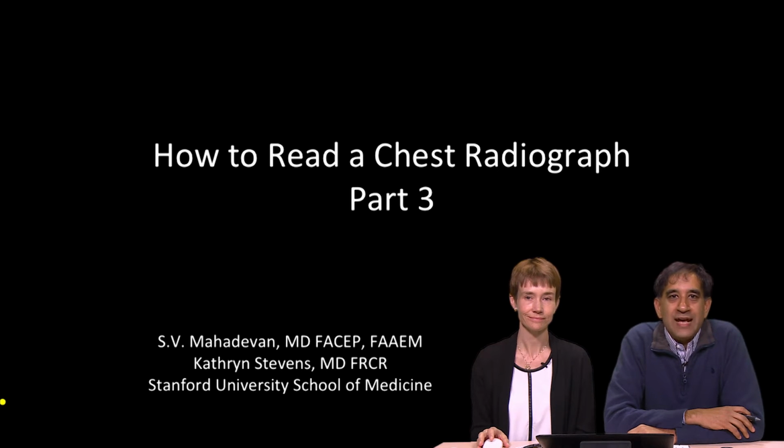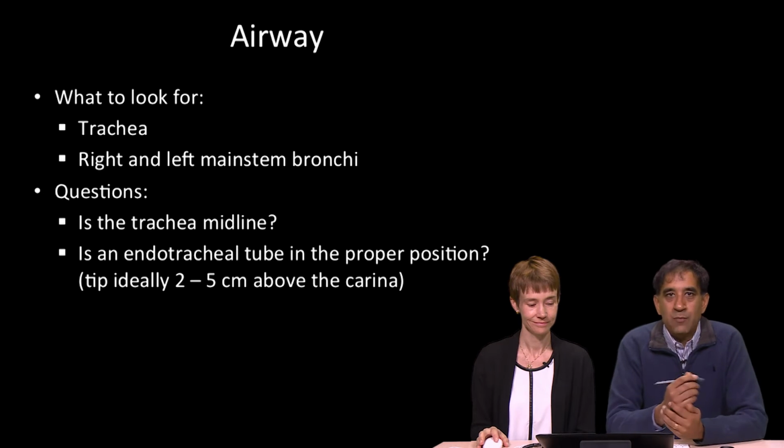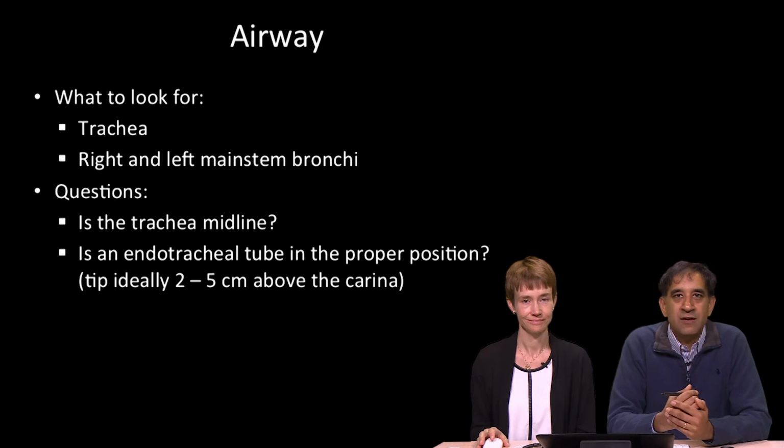I'm here with Dr. Kate Stevens, and we are going to go into how to read a chest radiograph, part 3. And we're going to start with evaluation of the airway. When we're talking about the airway, or the ABCs of chest x-ray evaluation, what are we looking for?